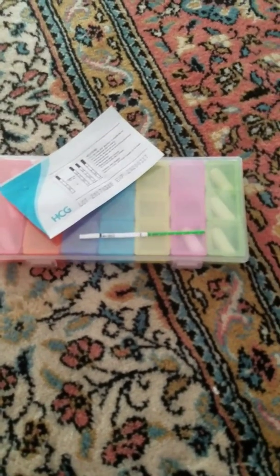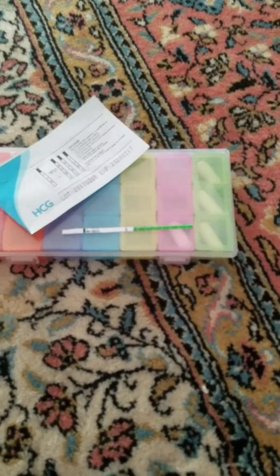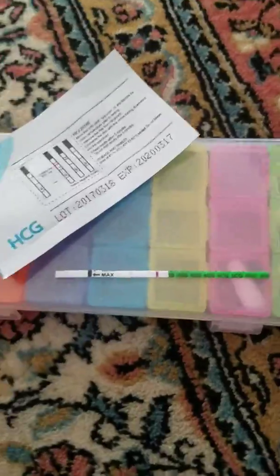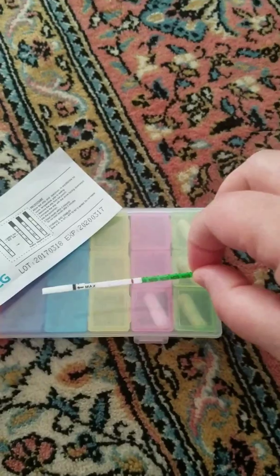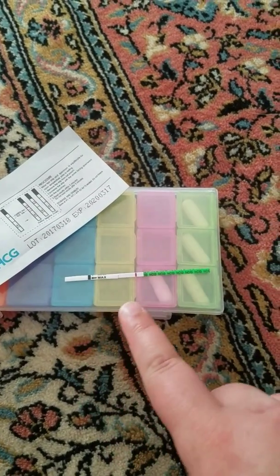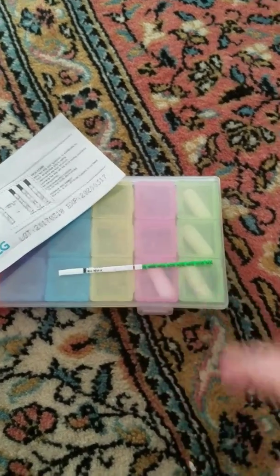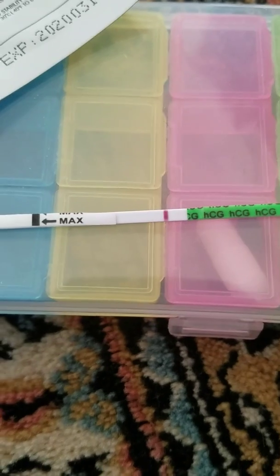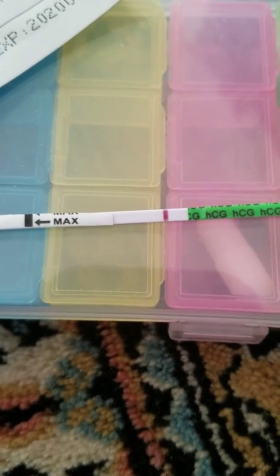Okay ladies, I know this is pretty blurry — it sucks — but I'm going to try to show you as best as I can. It is a negative. Ladies, do yourself a favor, don't make yourself go crazy. This is a negative. I could see it. That is definitely, definitely a negative.